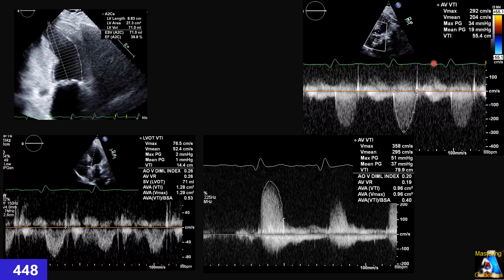Even here the rhythm is sinus and regular. What is the rule — do we measure the highest, the lowest, or the average of all beats? The same applies for continuous wave Doppler (pedoff): do we use the average or the highest one? What about PVCs — do we measure after a PVC when we have LV dysfunction or not? As you can see, we also have variance between LVOT measurements — smallest, average, and highest. Which do we use?